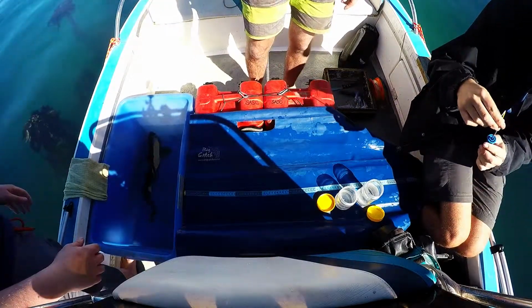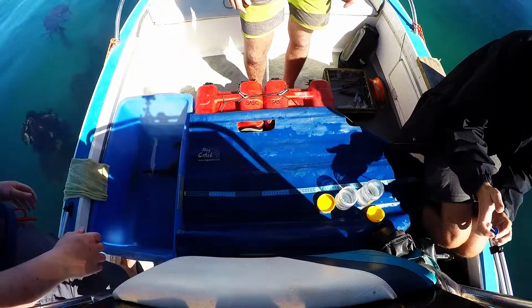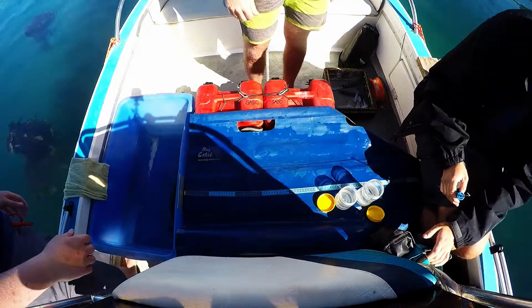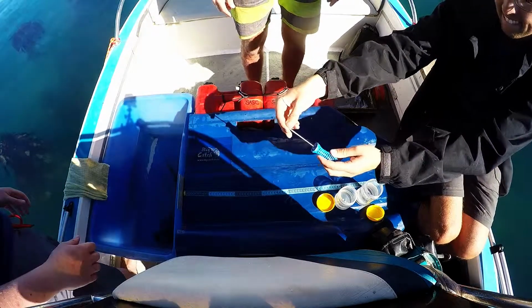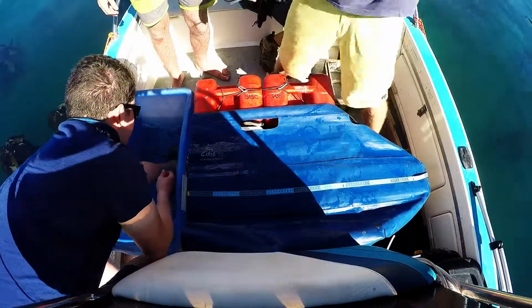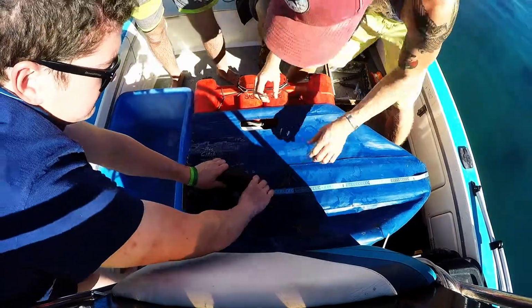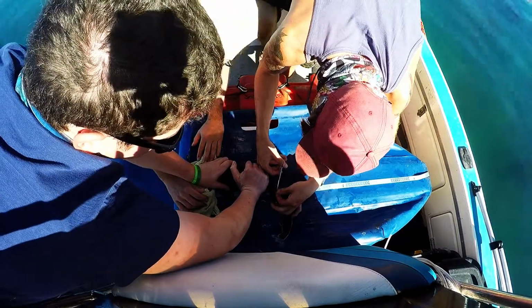Each tag has a unique identification number so that each individual shark can be identified should it be recaptured. It is advisable to take note of this number before the tag is implanted into the shark, as this greatly reduces the difficulty. With the unique identification number noted down and the tag inserted into the applicator, you are now ready to begin the tag application process as well as fin clipping.